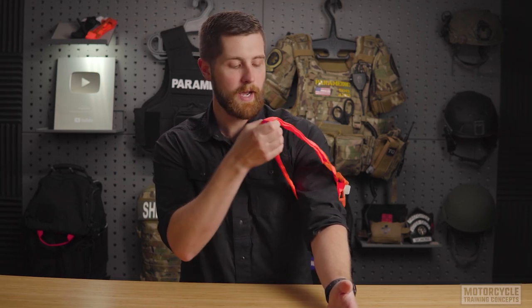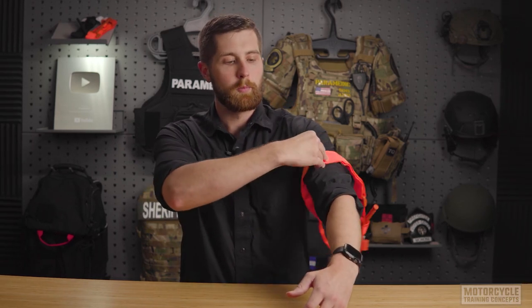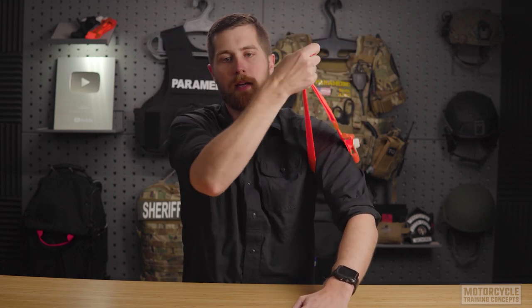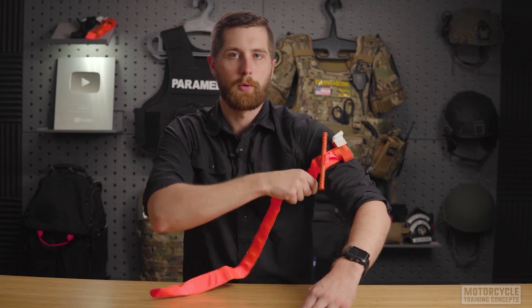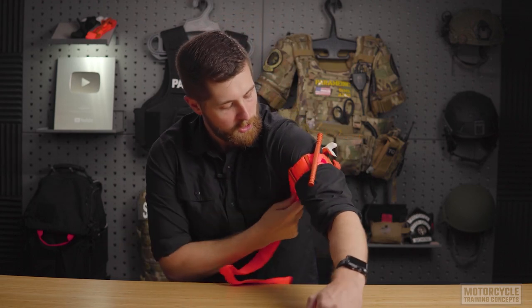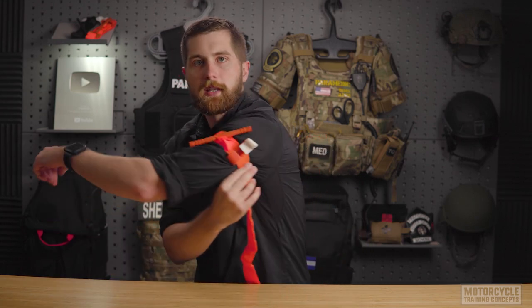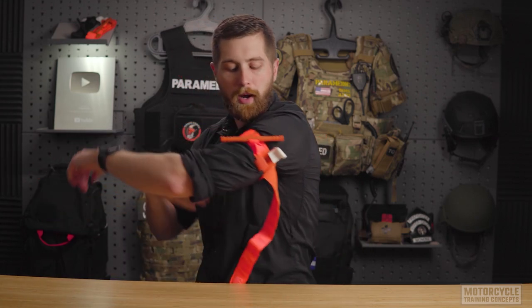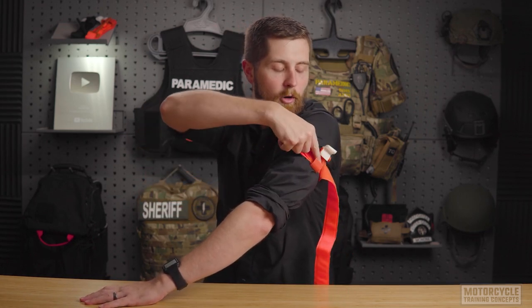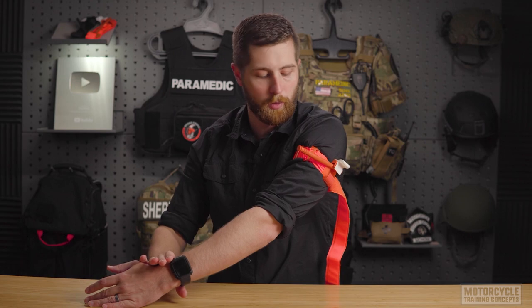When putting this on, I want to make sure this red tab is towards the heart. I'm going to go high and tight, and tighten this down as much as possible without even turning the windlass. I tighten that down, take the strap all the way back but let it hang before it gets to the bracket. I then take the windlass and tighten it until all blood flow has stopped in the lower extremity.